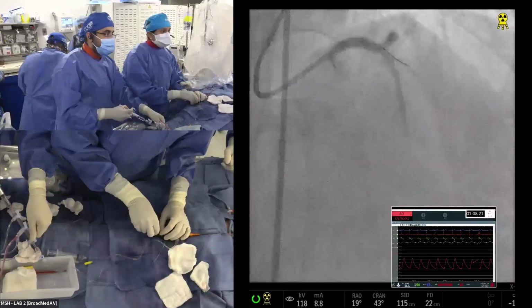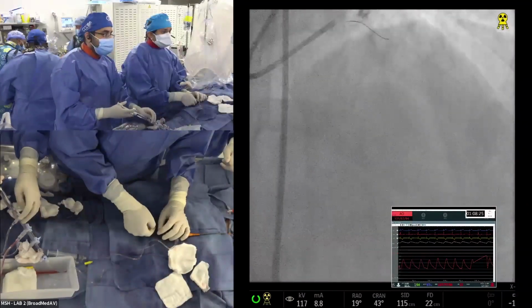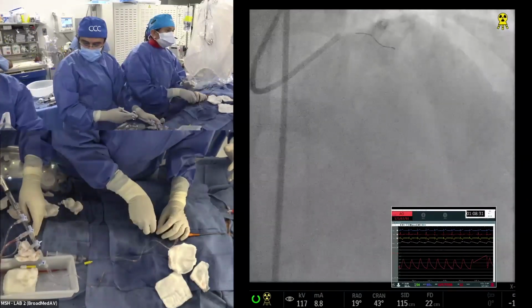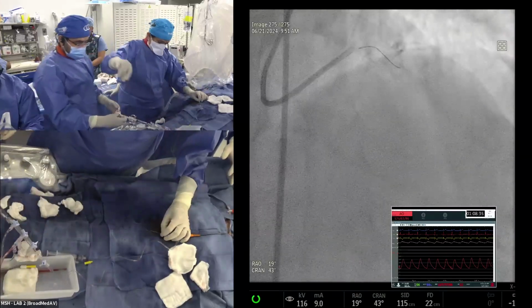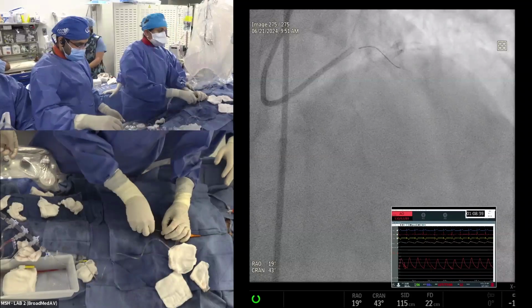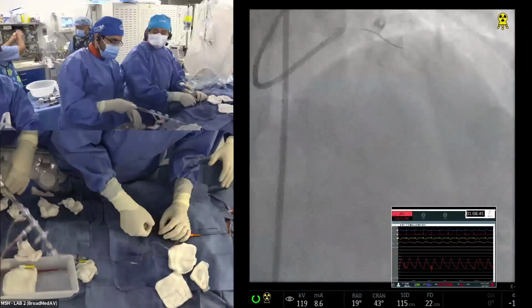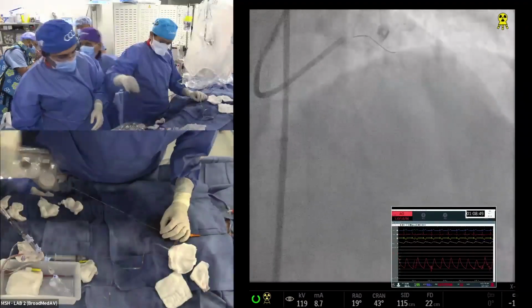Fascinating strategy. Many of us would actually finish the rota in both vessels and then do the cutting balloon, but this is novel. That is okay too. I think there's nothing wrong with that. In this case not, but sometimes if your lesion just went from 90% to 70 plus percent, doing a balloon of the main vessel after the rota is probably beneficial in my opinion. But doing the rota of both the branches is probably fine, and the burr will be a 1.5 burr.